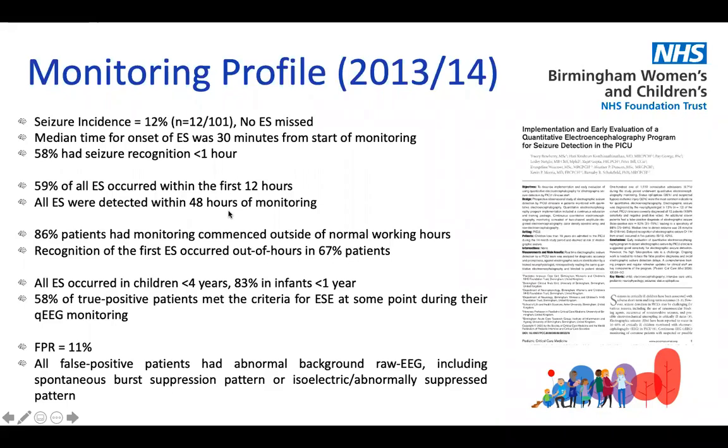60% of all the seizures in the patients happened in the first 12 hours, and we had no children who had any seizures detected after the first 48 hours of monitoring, whether that's because of the seizure profile itself, the nature of the injury, or the fact that we have treated what we found. But again, it's useful for resource allocation of our machines. We only have 3 machines on the unit, so this has been a useful factor going forward if we have new patients in and require a 4th machine, as to who we should or shouldn't take off monitoring.